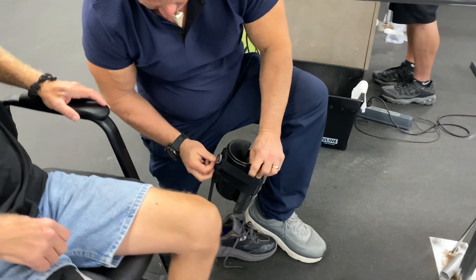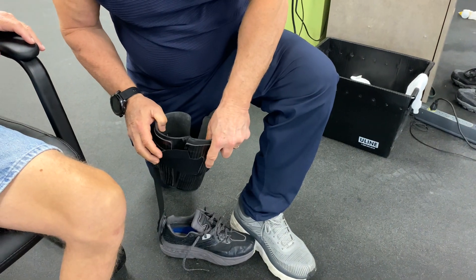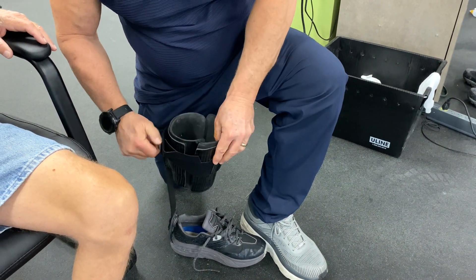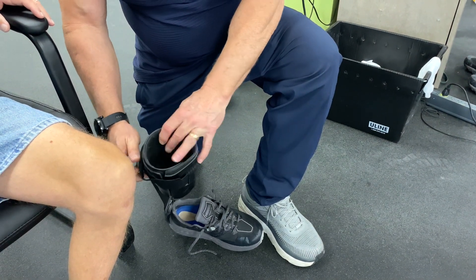See, this is a BOA system. You loosen that and this comes in, and you crank it and it tightens up, draws it in. So you don't have to do the strap.